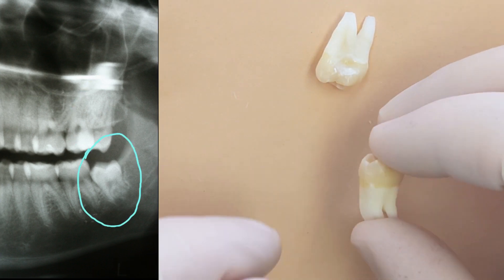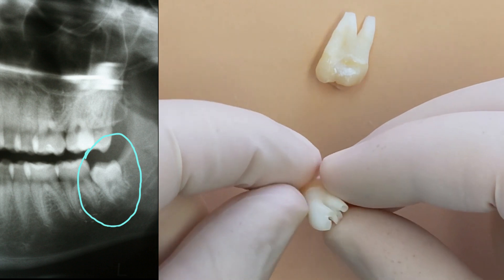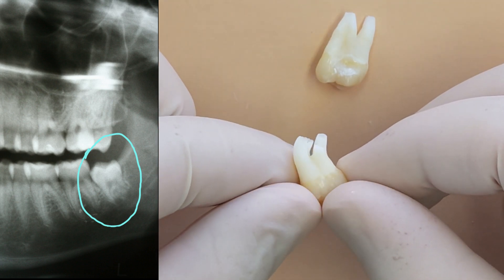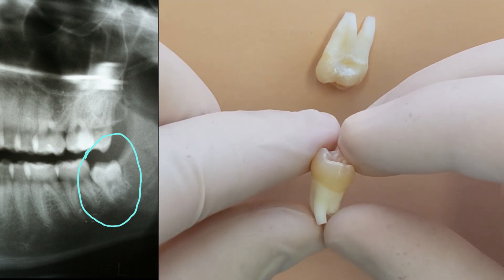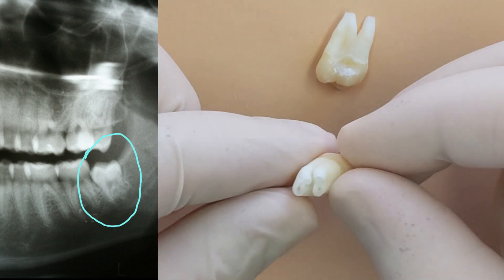And then the lowers have a little bit more of a molar shape to them, but again the roots are not fully formed. Look at the size of those apices — those holes in the root tips. If either of these teeth needed root canals at this stage, the endodontist would have a hard time doing that. They would have to do something called apexification — try to get it to finish growing before they could do it.